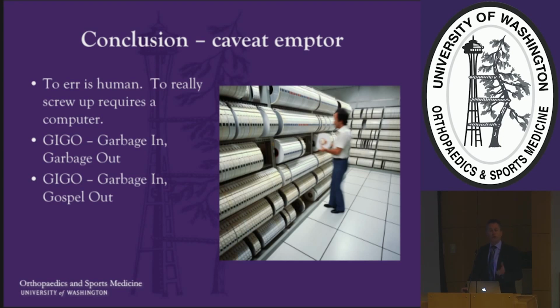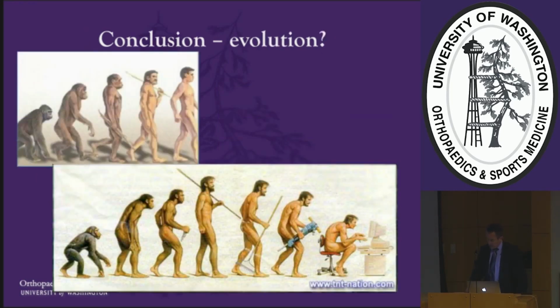And the problem is that what you do with a computer depends almost entirely on the information that you input. Garbage in, garbage out, all right? And the problem is that we tend to look at this and go, well, we've put some garbage in, but it's on the computer, so it must be wonderful. So we have this idea of garbage in, gospel out, and that's simply not the case. So when you consider the expense, the added time, the added effort, the resources that you have to throw in, and then realize that at the end your results are no better, it's hard to argue that computer navigation is helping.